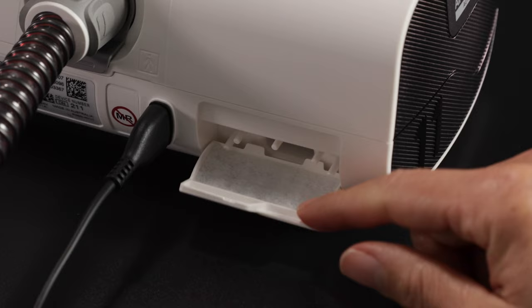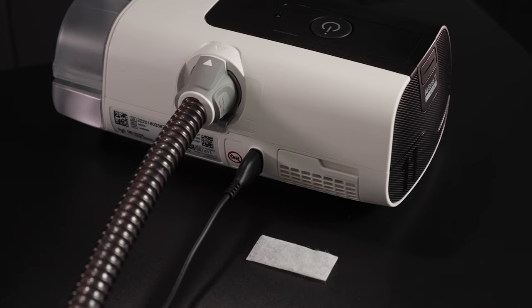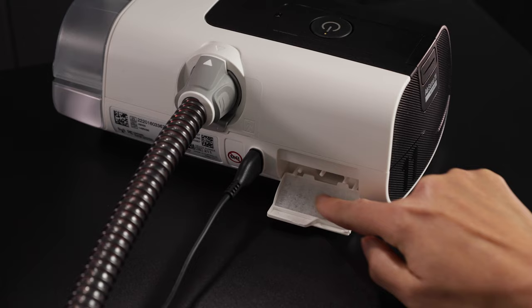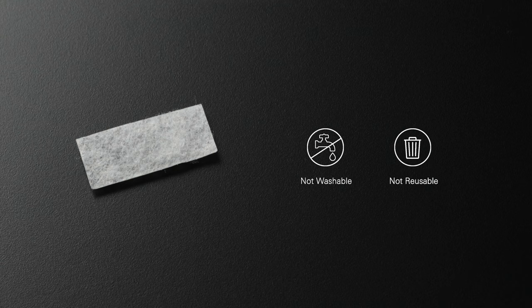Replacing the air filter. Open the air filter cover and remove the old air filter. Place a new air filter onto the air filter cover and then close the cover. Make sure the air filter and air filter cover is fitted at all times to prevent water and dust from entering the device. The air filter is not washable or reusable.